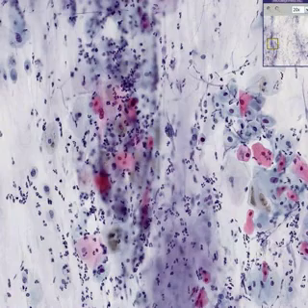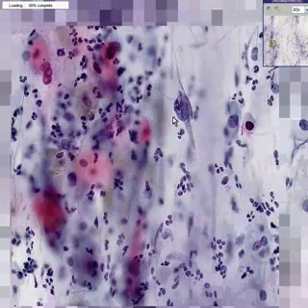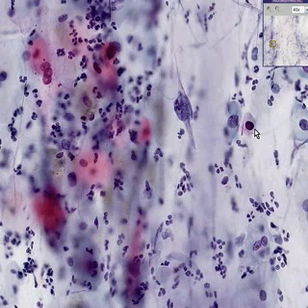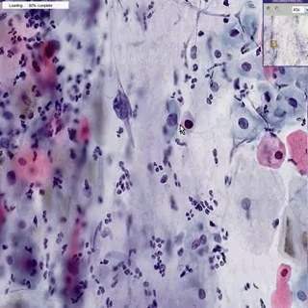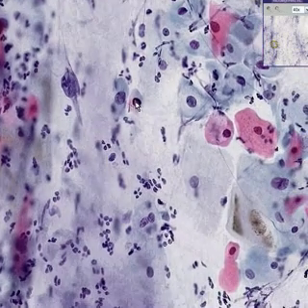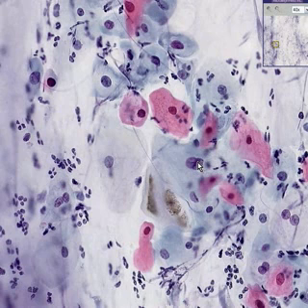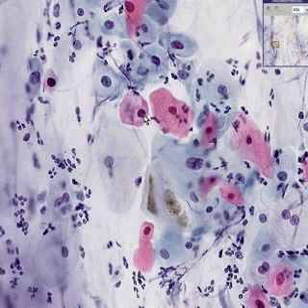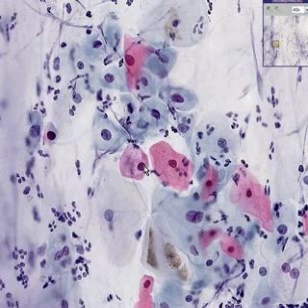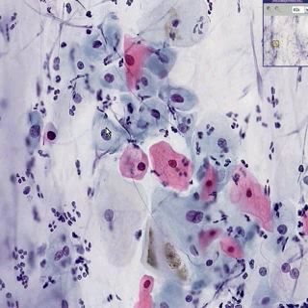What do we see here? We see a nucleus that is bigger than it should be, a little darker than it should be, and a little bit lumpier than it should be. These are all atypical dysplastic or intraepithelial lesions. If I told you that those three or four cells we just saw were the worst you'll see, and they are not as bad as what we saw with the high-grade SIL, you would instantly diagnose low-grade SIL.